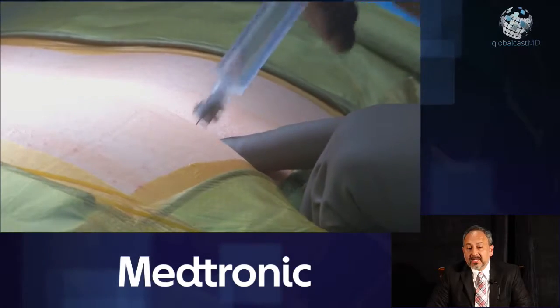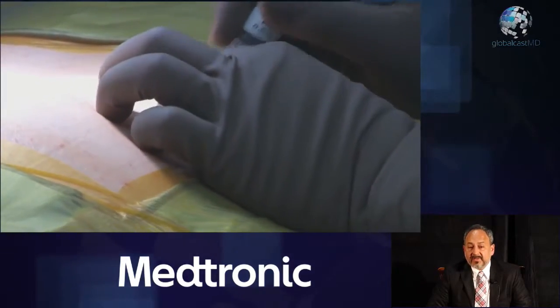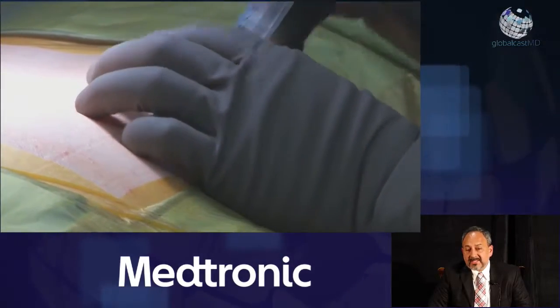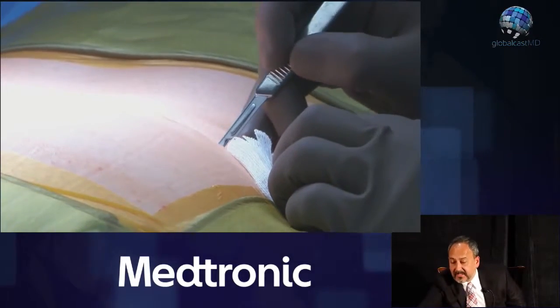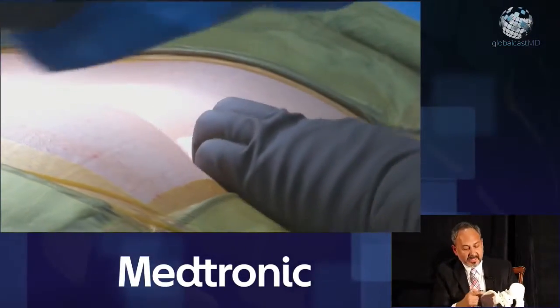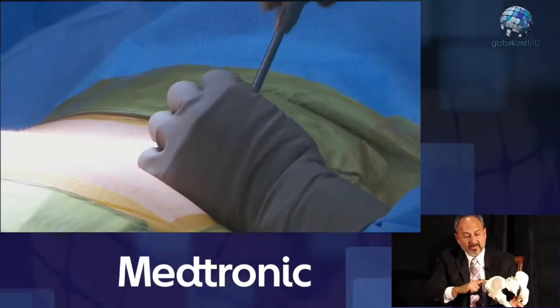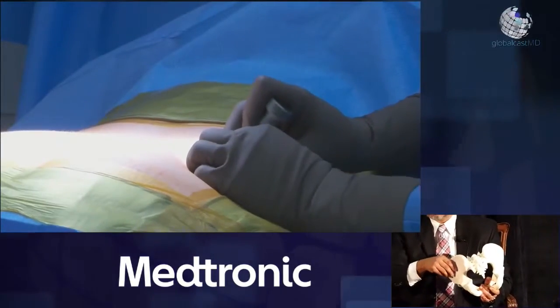On the imaging studies you'll see her pre-existing Rialto implants. Right now what I'm doing is palpating the edge of the PSIS, the posterior iliac crest, out laterally. I am following the PSIS anteriorly and laterally, as far away from midline, where we're closer to midline where my operation is going to take place.